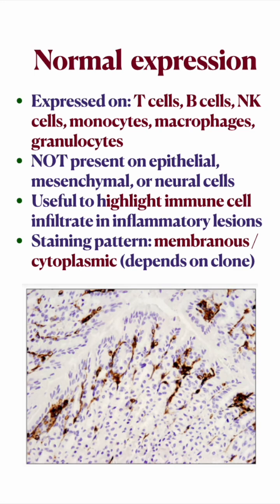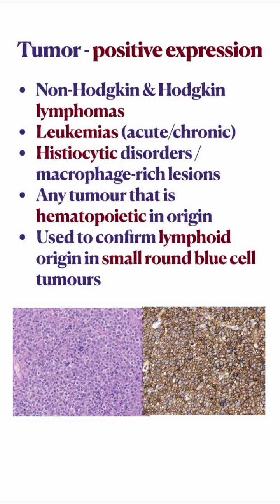CD45 is used to highlight immune cell infiltrates in inflammatory lesions, where they can sometimes be mistaken for malignancy. The staining pattern is membranous and cytoplasmic. It is positive in lymphocytes, and therefore positive in tumors of lymphocytes — that is lymphomas, leukemias, and histiocyte-rich disorders. Any tumor of hematopoietic origin will be positive for LCA or CD45.